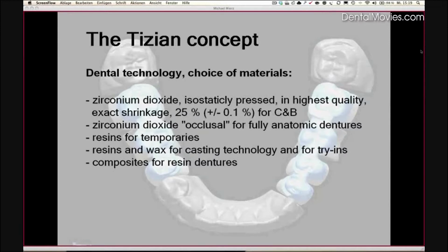You can produce an acrylic resin model, send it to the dentist, let him try this model on the patient's side, maybe modify it, grind it, and if it fits optimum, you can mill it in zirconium or any other material you may desire.